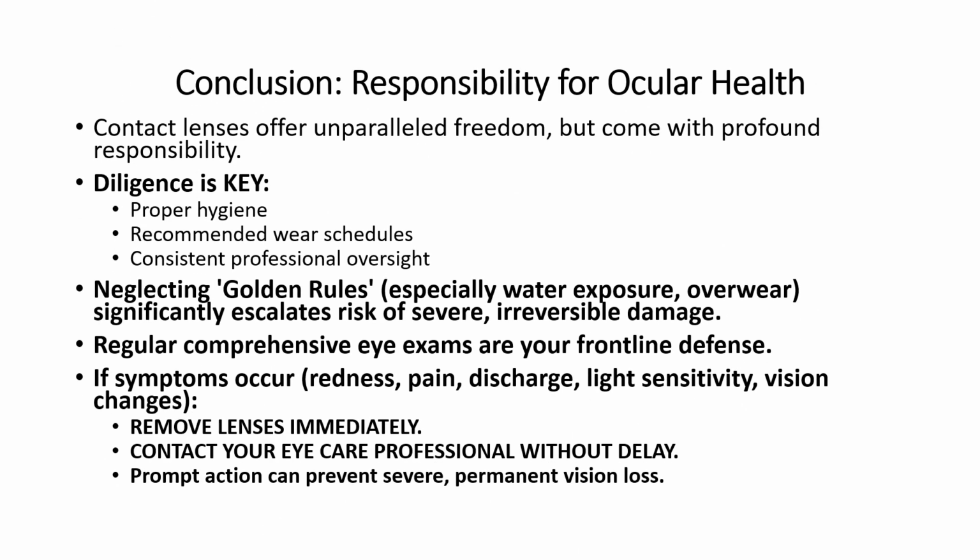In conclusion, contact lenses offer unparalleled freedom and convenience for vision correction, truly revolutionizing the lives of millions. However, these profound benefits come with an equally profound responsibility. The overarching message is clear: diligence is key. This means strict adherence to proper hygiene, recommended wear schedules, and consistent professional oversight are not merely suggestions, but absolute necessities. Neglecting these golden rules, particularly regarding water exposure and overwearing your lenses, significantly escalates the risk of severe and potentially irreversible damage to your vision.